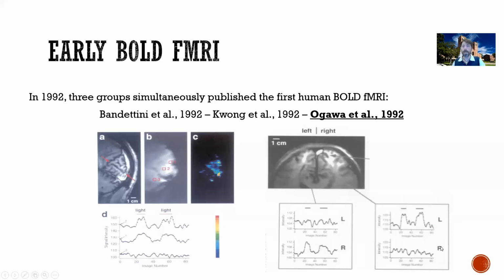And yet again, if you stimulate the right eye, remember, this is right cortex, so it doesn't receive much stimulation from the right eye, you see that the T2 signal doesn't change much in here, despite the presence of the stimulation.